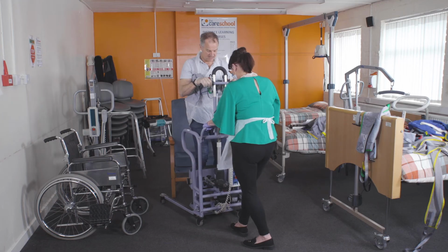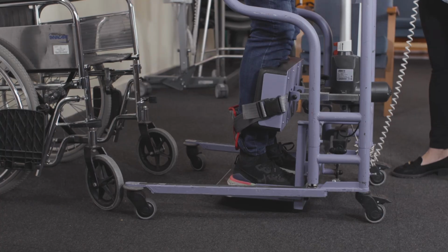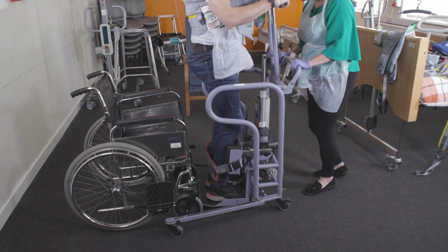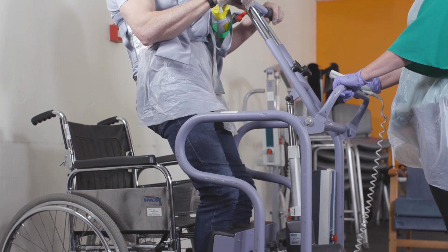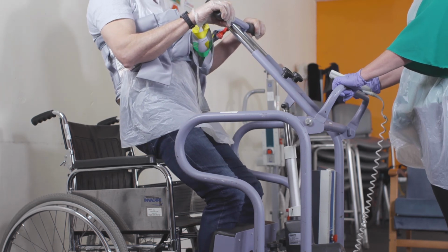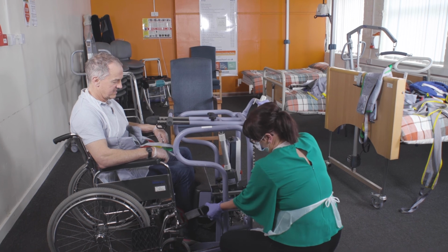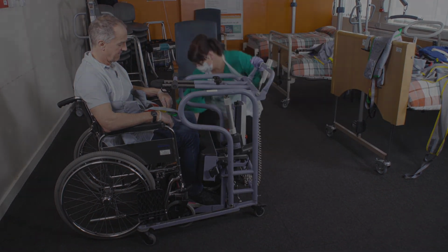Move the standing aid and open the legs as you manoeuvre the standing aid to the desired seated position, and make sure that the service user can feel the chair at the back of the legs before lowering the service user into the chair. Once in the chair, ensure that the straps are taken off and remove the standing aid.